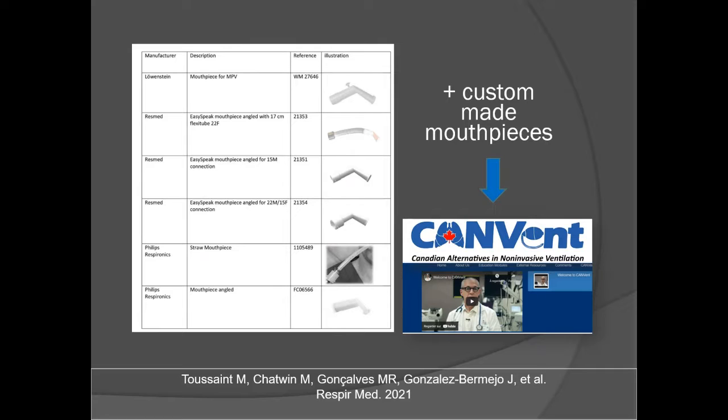There are many different mouthpieces, and all the companies have developed their own mouthpieces. If you are interested, there is a fantastic website. The name is CanVent, and you see here our colleague Doug McKim from Ottawa explaining different things regarding customized mouthpieces. This is open and free access.